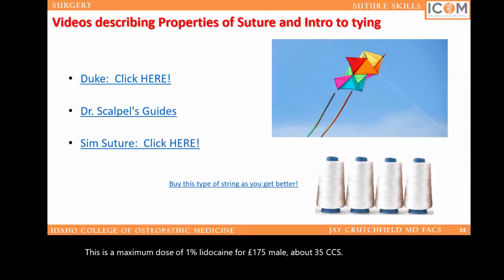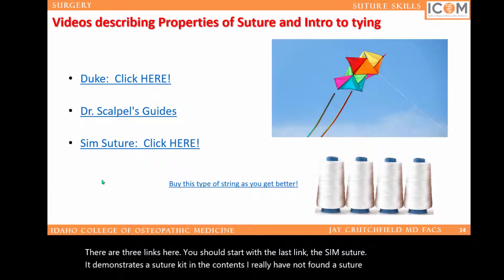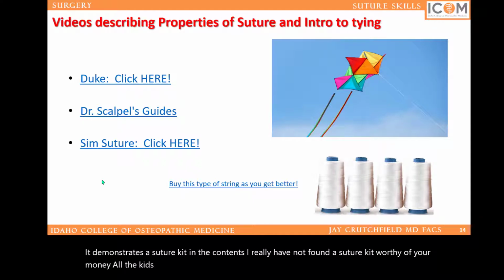There are 3 links here. You should start with the last link, the SIM suture. It demonstrates a suture kit and the contents. I really have not found a suture kit worthy of your money. All the kits we recommend you buy from Amazon are not really very good, but they're better than nothing.